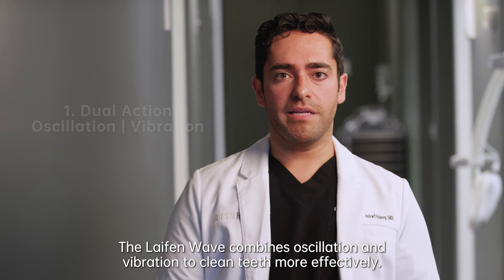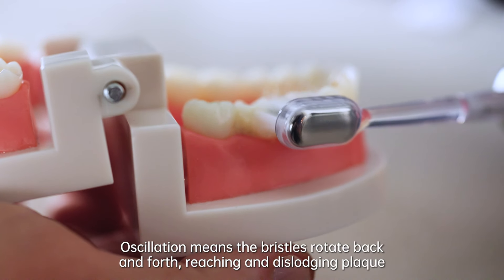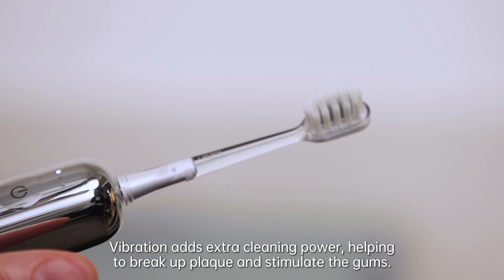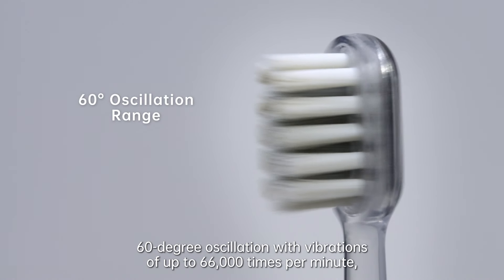The Laifen Wave combines oscillation and vibration to clean teeth more effectively. Oscillation means the bristles rotate back and forth, reaching and dislodging plaque from tight spaces between teeth. Vibration adds extra cleaning power, helping to break up plaque and stimulate the gums.